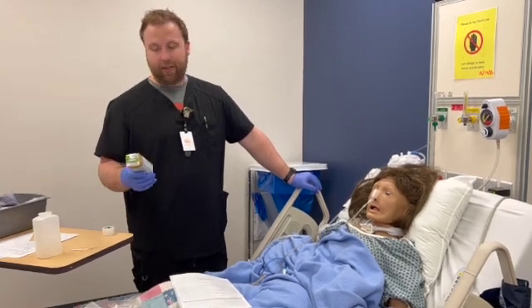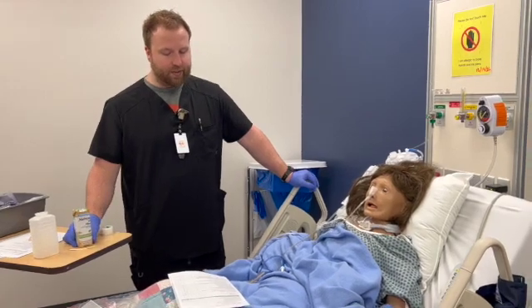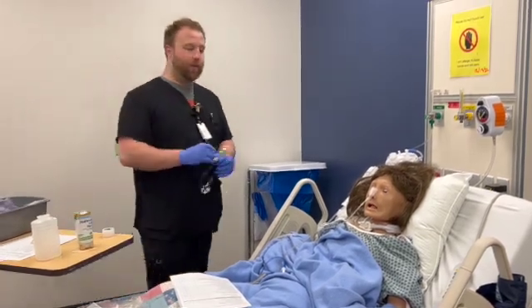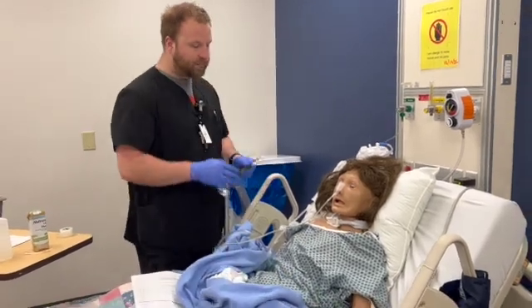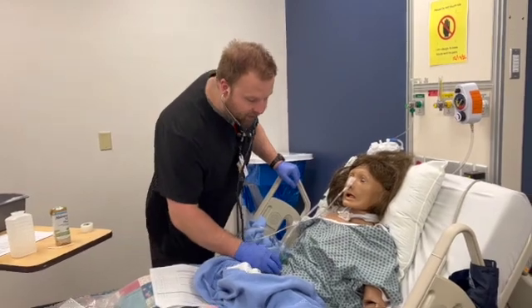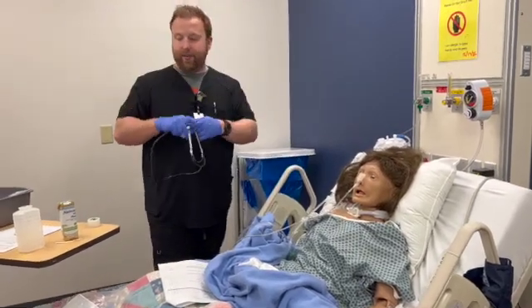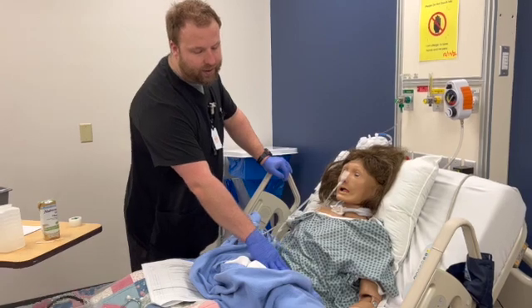Informing the patient that you're going to be receiving Nutrin 1.0 fiber, 240 mLs, and we're going to perform our abdominal assessment. We're going to look at the abdomen. We're looking for any bloating, any swelling. Next, I'm going to listen to all four quadrants. We're listening for bowel sounds here. And then the last thing I want to do is feel, making sure that it's not firm or anything.